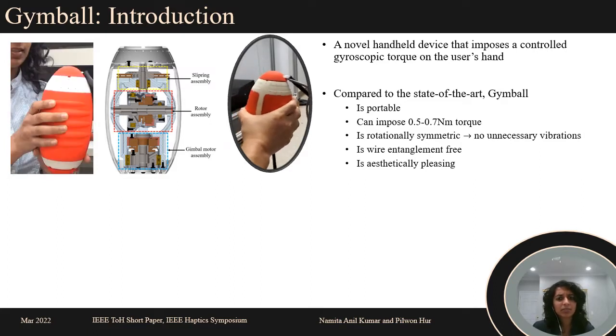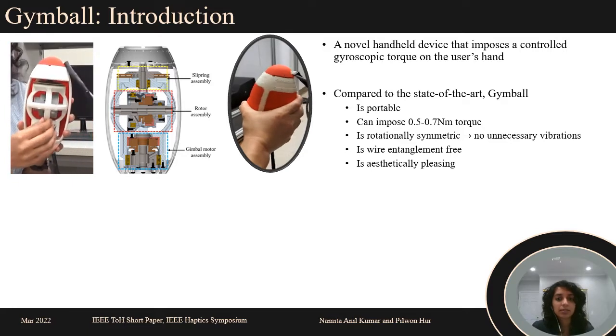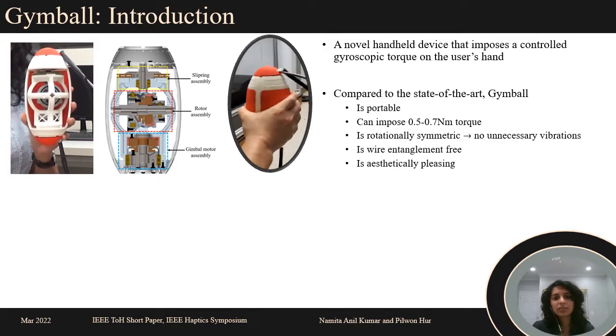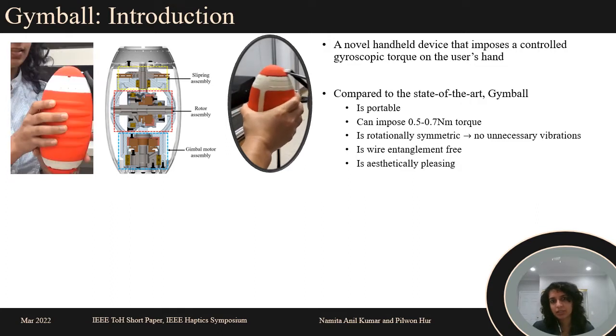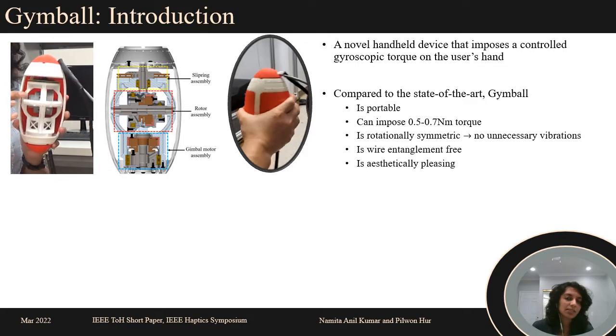Major challenges with gyroscopic devices are vibrations due to rotational imbalances and wire entanglement. The former is solved by adopting a rotationally symmetric design, while the latter is solved using slip rings.